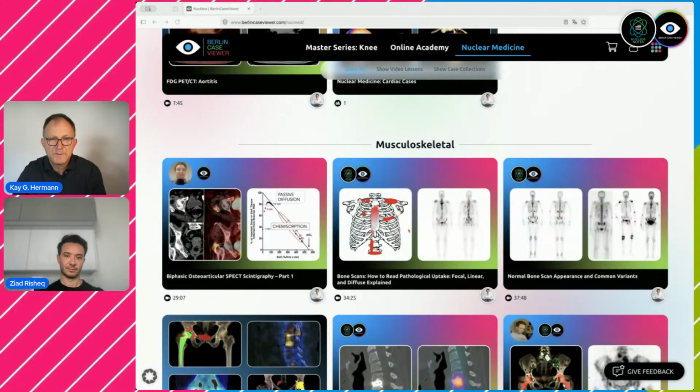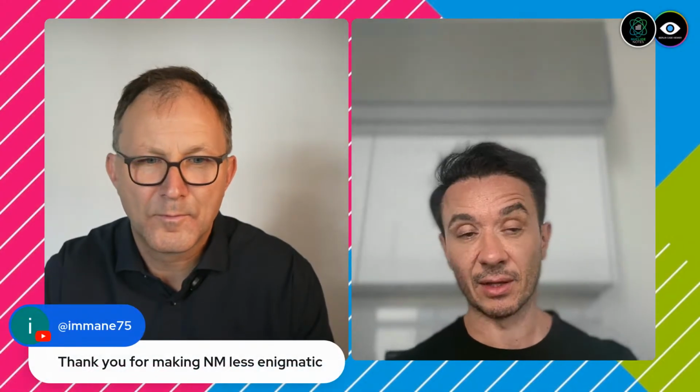Great. So this concludes our session. Thank you very much, Ziad. We had 2 cases; I was hoping to do more than just 2 cases. The second one was really difficult, but it really highlights the value of SPECT CT, not just in diagnosing septic or aseptic loosening, but in detecting the abnormal biomechanical loading or stress transfer around the femoral stem. So you can detect these abnormalities, and no other modality can do that.